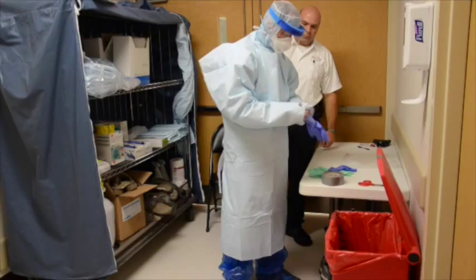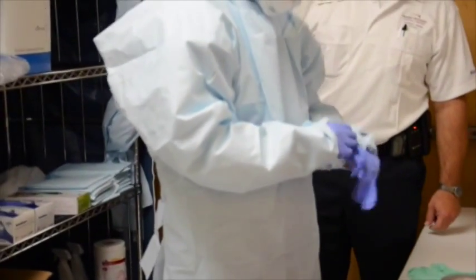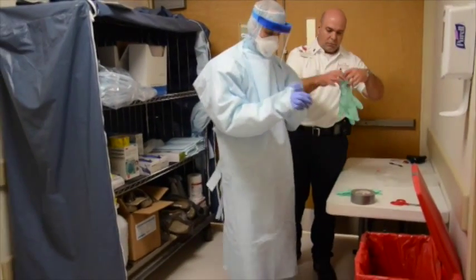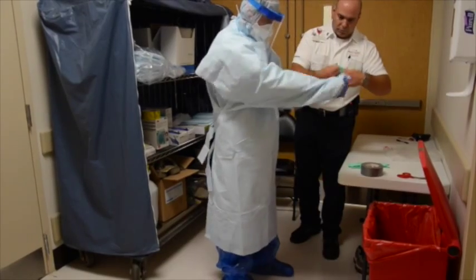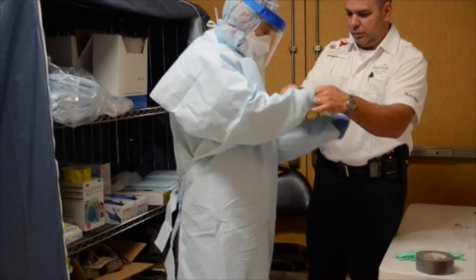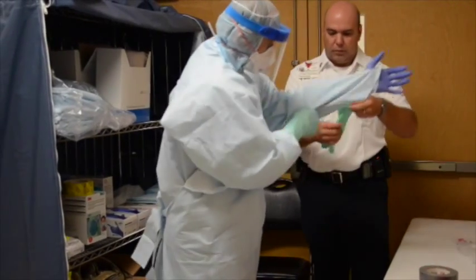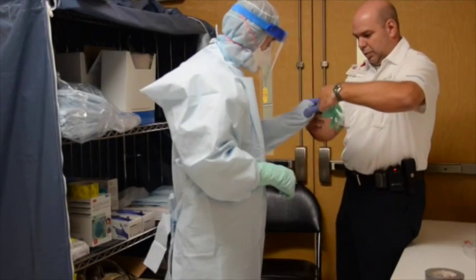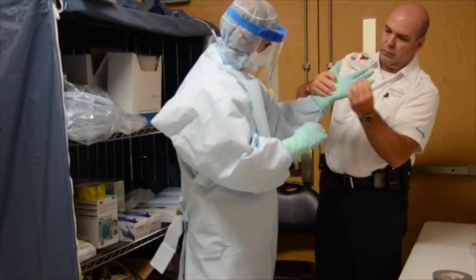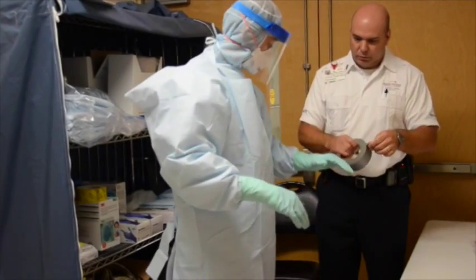Apply standard nitrile gloves and pull gown cuff down over top of gloves using thumb holes. Apply long-cuff nitrile gloves over top of standard gloves and over top of gown cuffs. Buddy will ensure proper glove coverage and tape glove cuffs to gown.